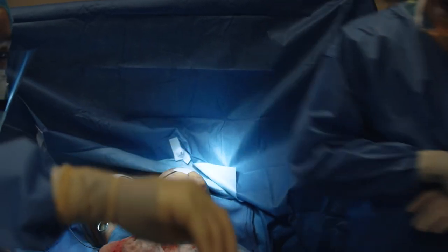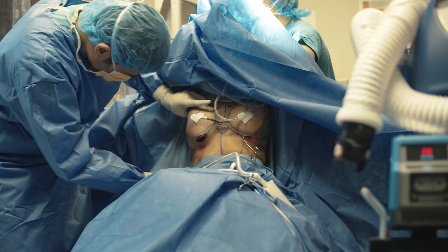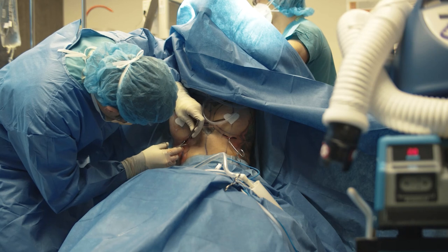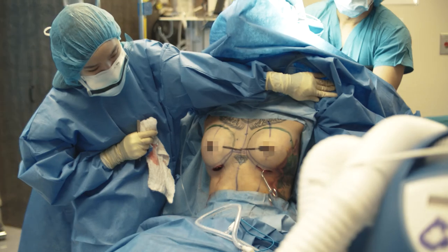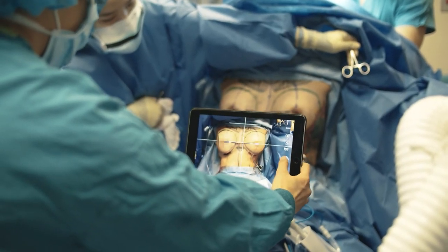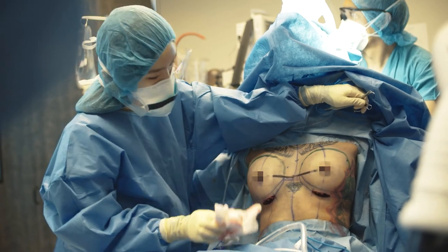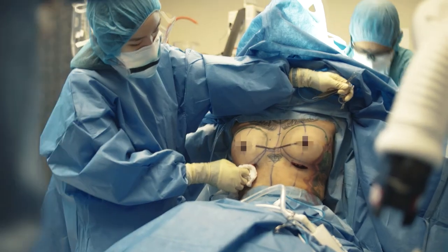Let me look at the other side one time so we set it up. Take multiple pictures to make sure we have the best view and everything looks good. Okay. Now I'm going to check the upper pole and the neck. We have it even. See that the left one's still a little bit higher. Let's just start anatomy. Here's more tissue there. That's perfect. It's a wild success.